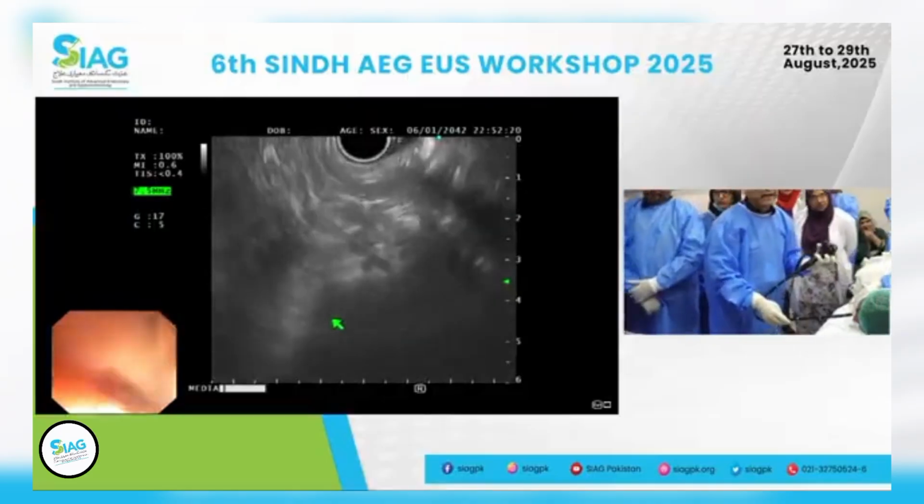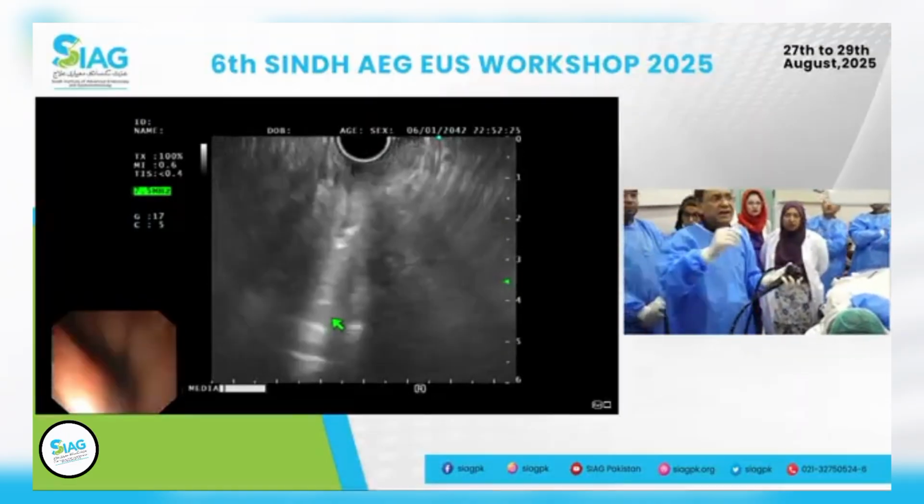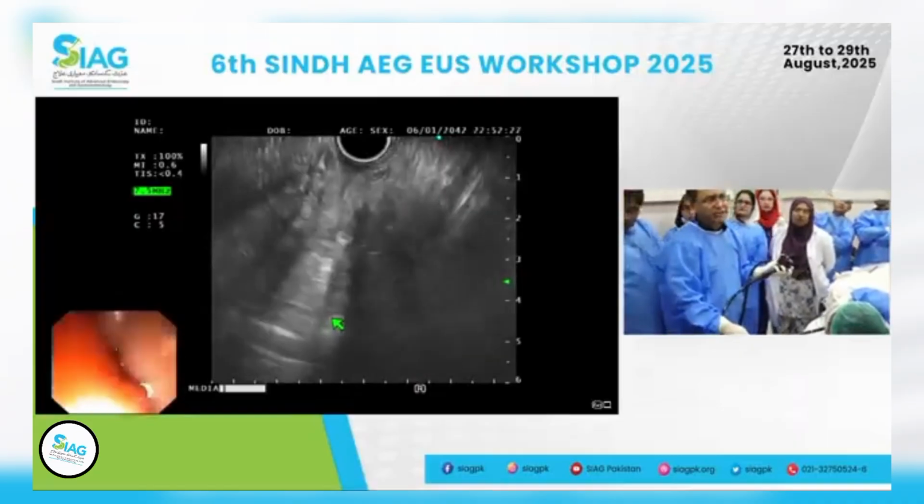So now moving to the next station, can you make the endoscopy image a little bit bigger, please?